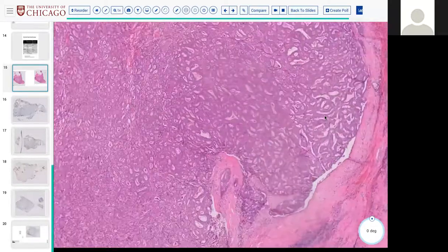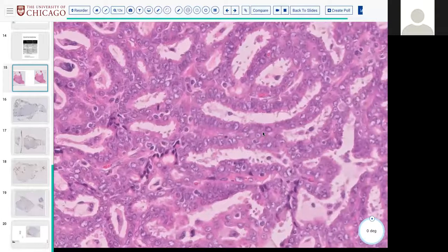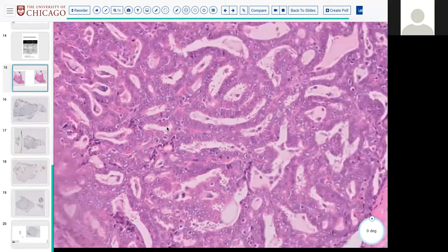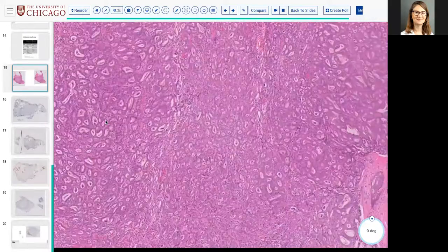Okay. Do we have any history for this patient? I think she's in her 20s or 30s. She has a thyroid mass, and she had an FNA and the FNA was called PTC. Isn't columnar maybe more pseudostratified than this would be? So probably not the columnar cell variant.